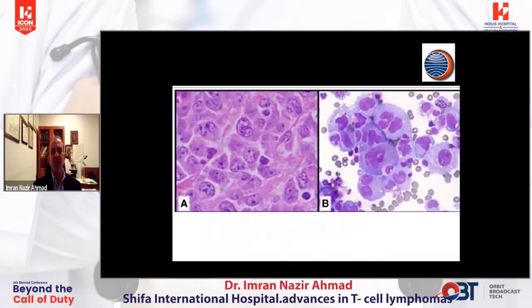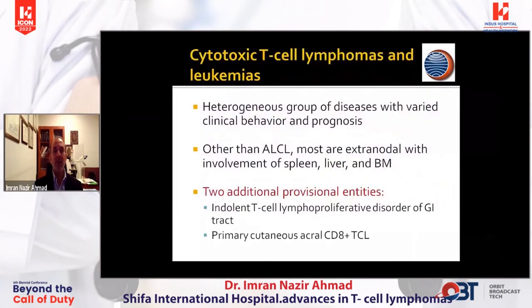So this is how these breast implant-associated anaplastic lymphoma cells would look. Really, really bizarre, large cells. You do see some hallmark cells, but they will be negative for ALK while they will be positive for CD30.